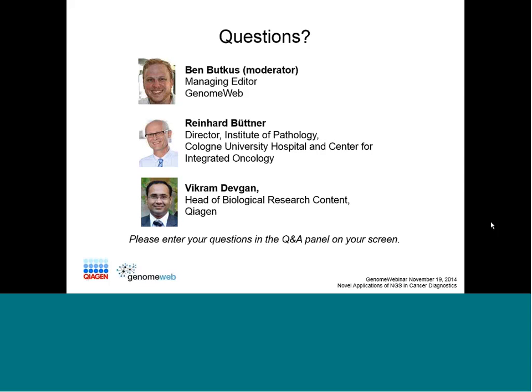Well, it's a difficult question, and it shows that even such a good old gene like EGFR, which has been probably sequenced 100,000 times all over the world, poses new questions in daily histological practice. I think there are different types of insertions, and a good data library to go to is the COSMIC library and also the cBioPortal from Memorial Sloan Kettering, the Chris Sander library, and check.